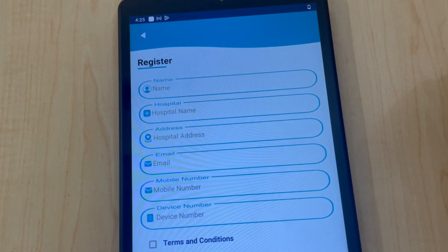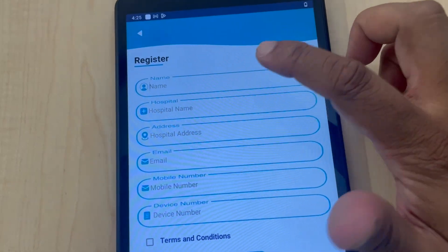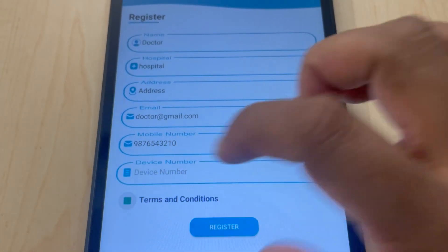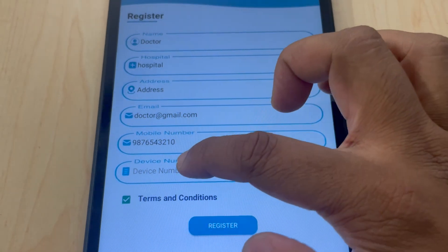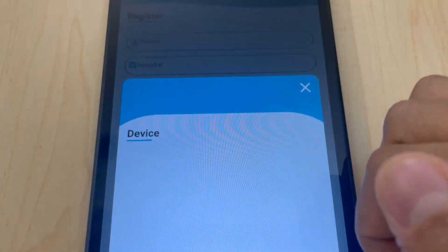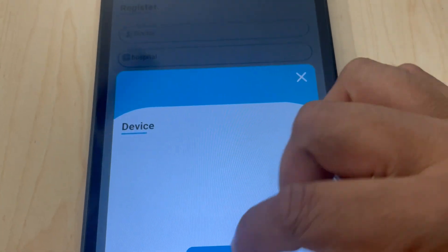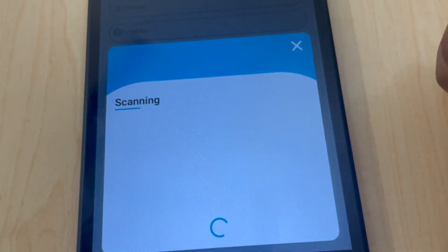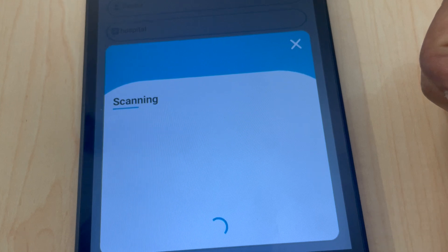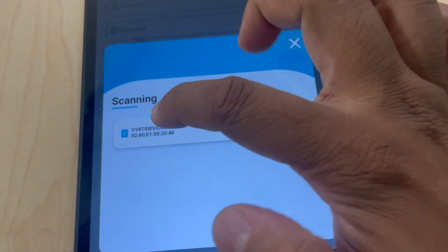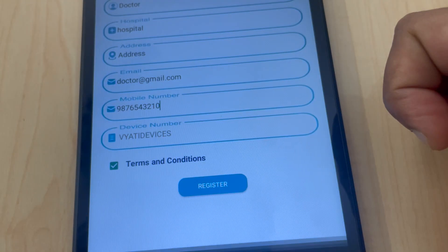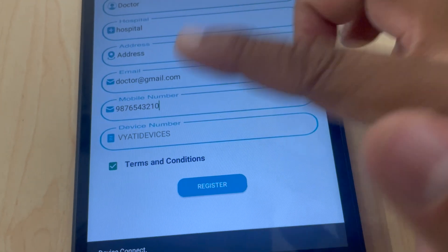Tap the register button and fill in the required details in the form. In the device serial number field, scan for the device and pair it. Click the register button to complete registration.